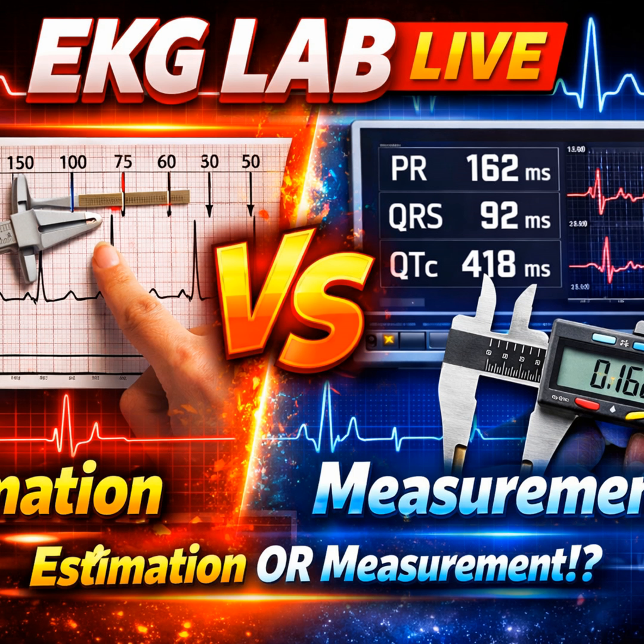To diagnose a pathological arrest versus a benign pause, precision is non-negotiable. You cannot just look at a gap in the EKG and say, wow, that looks like a long time. That felt like an eternity. Feelings are not data. The protocol for measuring a pause is clear and must be followed. You count the number of boxes between the R waves of the preceding and subsequent complexes. First, you count the full large boxes and multiply by 0.20. For example, if there are exactly 5 large boxes, that equals 1.0 second.